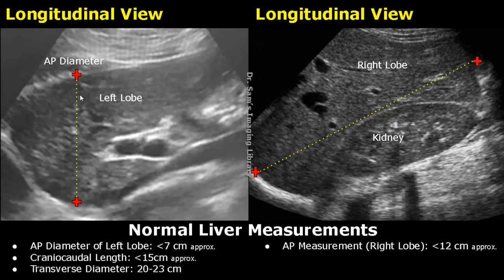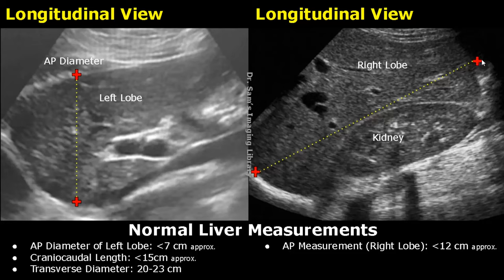For the right lobe, a craniocaudal length is taken. It is usually less than 15 cm. When the right kidney is fully visualized, we can measure the craniocaudal length. One caliper is placed just below the diaphragm and the other caliper is placed at the inferior margin of the liver.